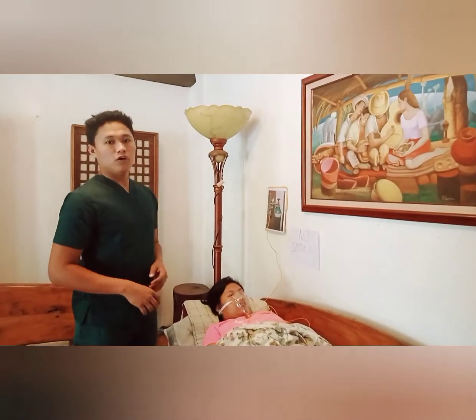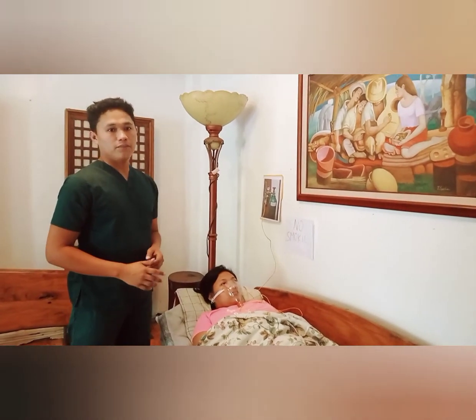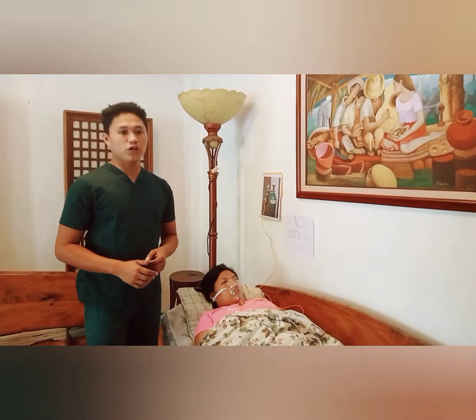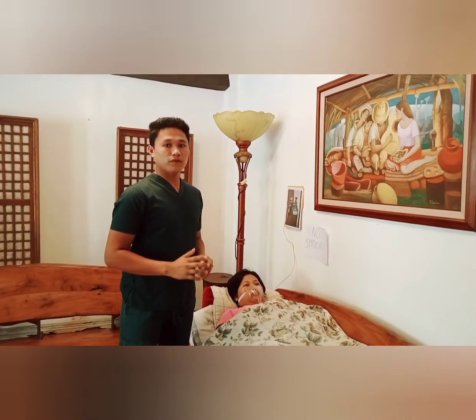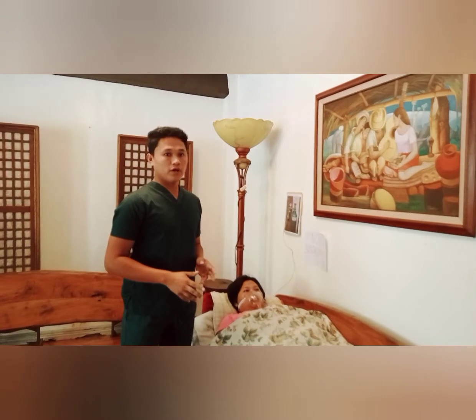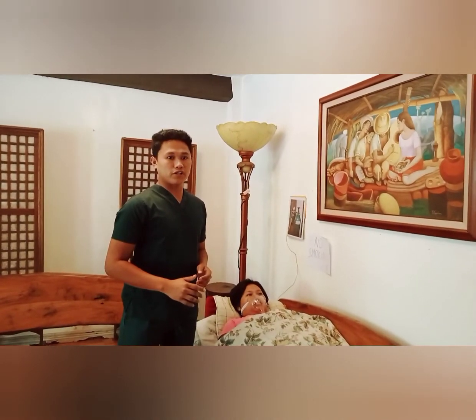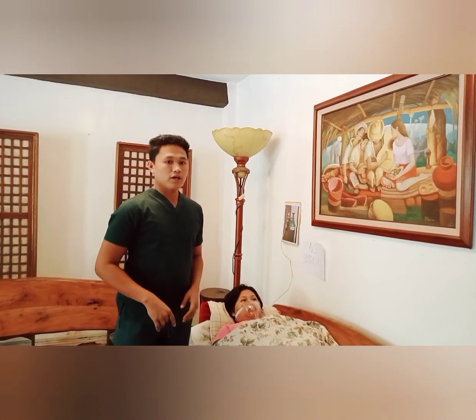And no lower oxygen is needed, and properly remove the gloves and perform hand washing to prevent infection and microorganisms. Then next, we are going to document the procedure and the client's reaction. Documentation provides continuity of care, and also we are going to sign the charts and report to the senior staff to maintain professional accountability.